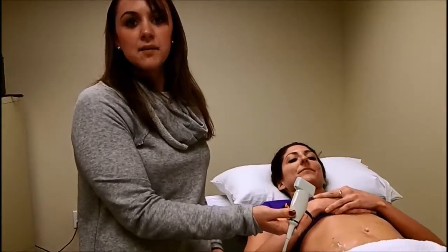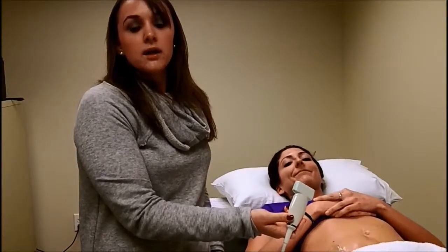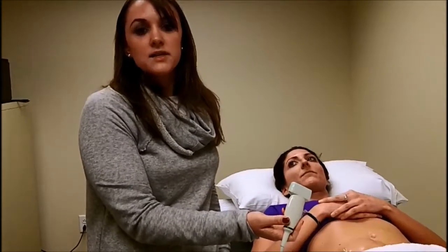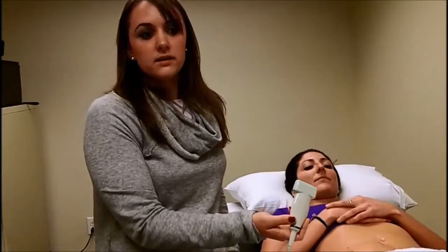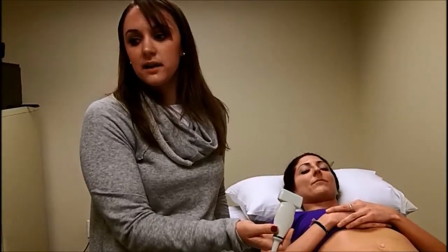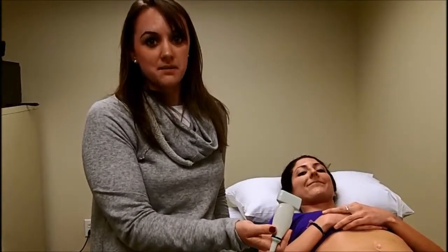Over time, they found an increase in thickness of the transverse abdominis and a decrease in low back pain, showing that increasing lumbar stability — in conjunction with home exercises and other interventions — was beneficial. Using the ultrasound imaging to show the patient what she was doing during the interventions helped decrease her pain.